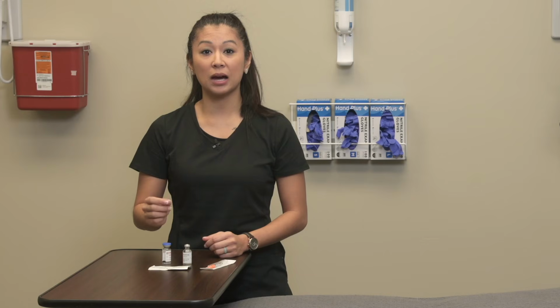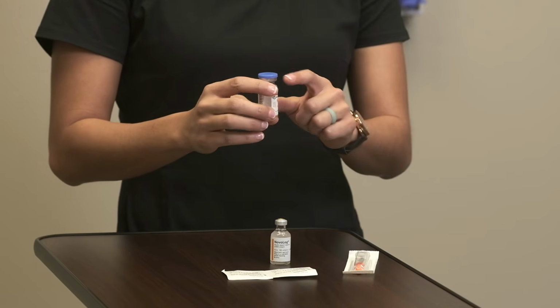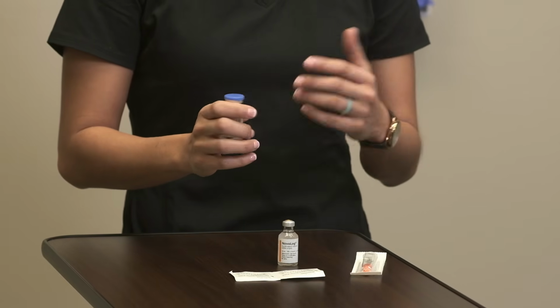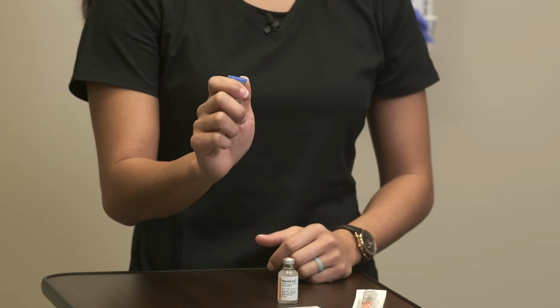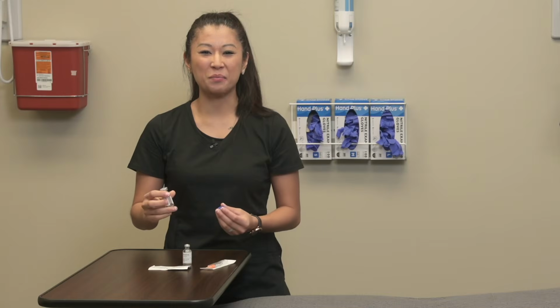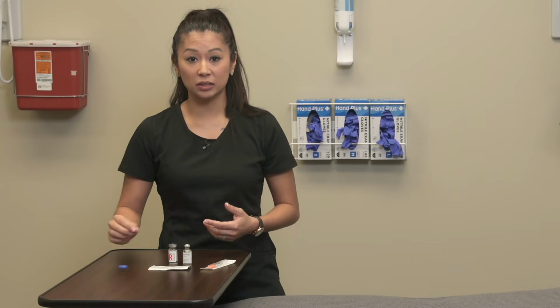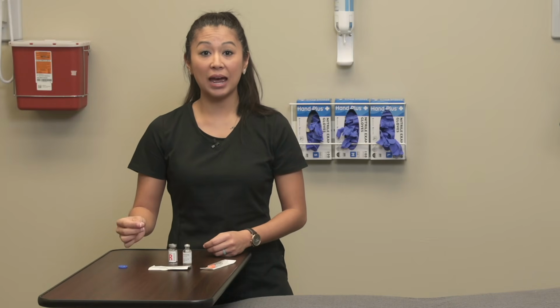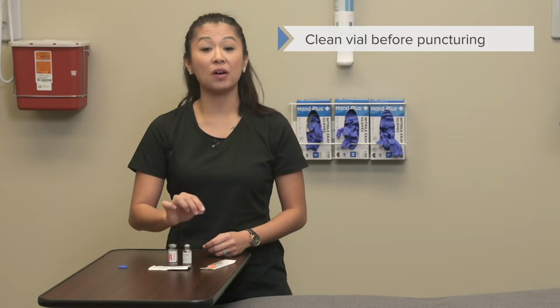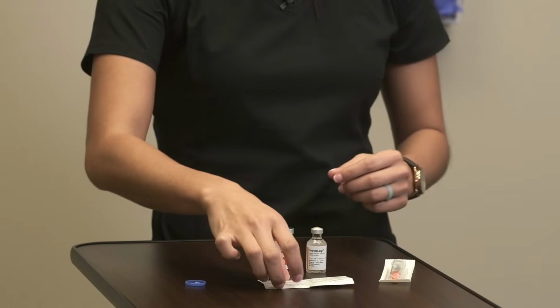Or if you're opening up a new vial, you may have one that has some sort of cap like this, and before use, you simply pop it off. I'm just going to take my thumb here, push it, and it very easily pops off for you. Again, these are multi-use vials, so even if I pop off the cap or the cap is missing, we always want to clean the vial off first before we puncture it. So I'm going to do that now.